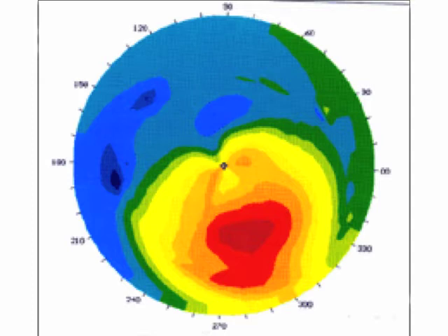It'll give us a reading that, let's say this cornea, maybe it will give us one reading that's of interest at about the 120 degree meridian and another one at the 30 degree meridian. The problem is that the reading that it's going to give us at 30 may represent what the curvature of the cornea is at 30. But the reading that's at 120 is going to give us the average power at 120.